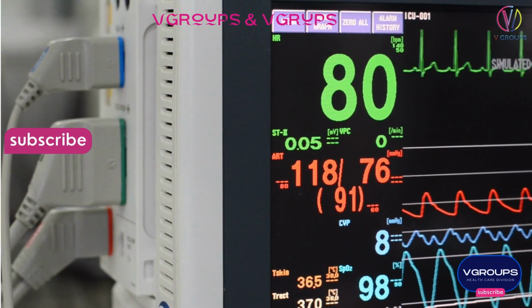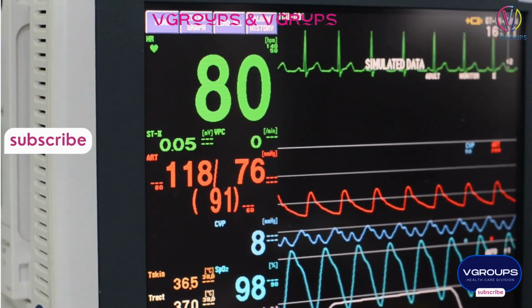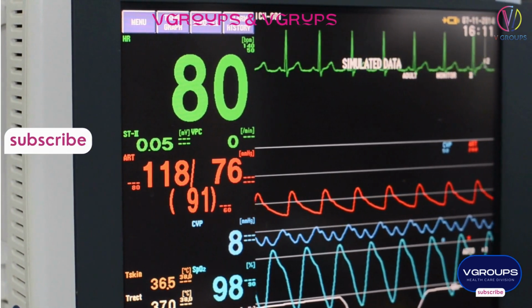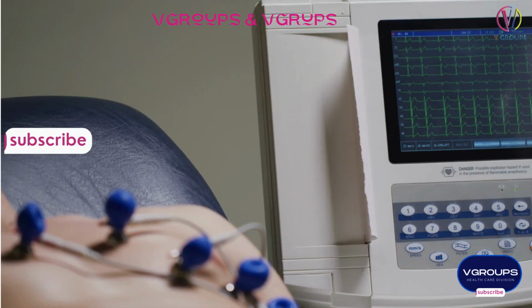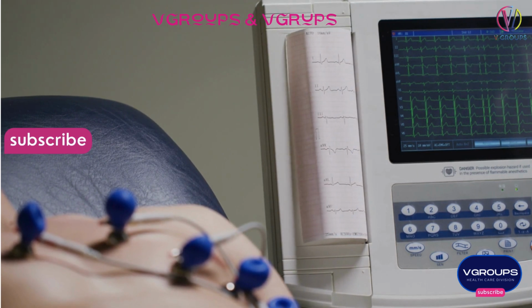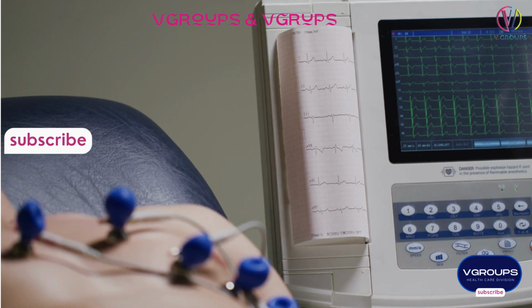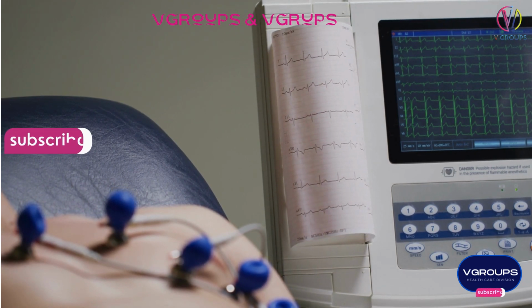Disadvantages and precautions. False positives: ECG results may sometimes show abnormalities that are not clinically significant. False negatives: in some cases, important heart conditions may not be detected by ECG alone. Interference: external factors like muscle movement or electrical interference can affect the accuracy of the results.